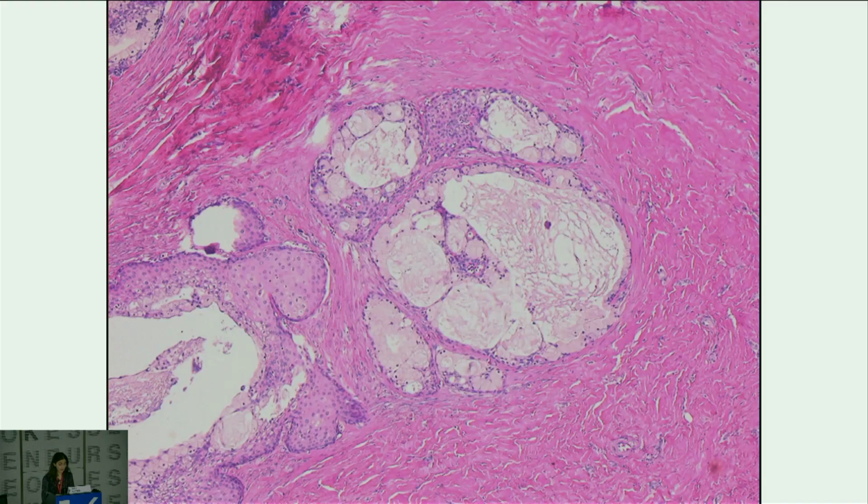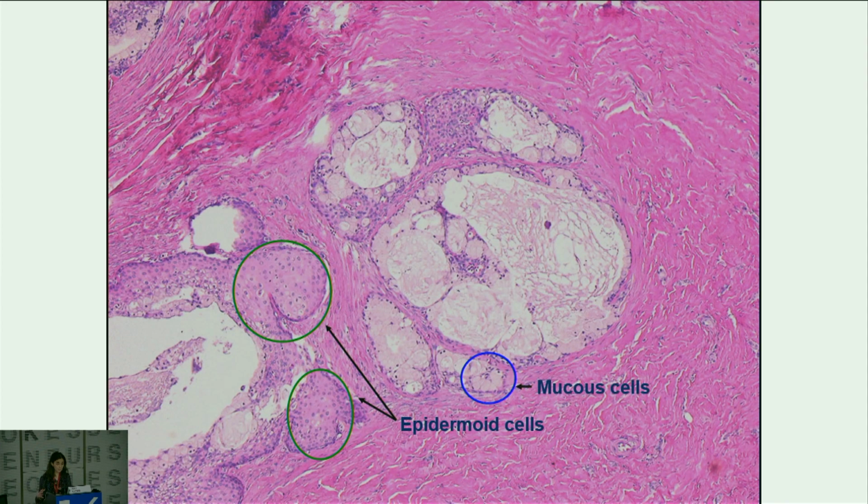Histologically, this tumor is composed of three cell types: the epidermoid cells that have abundant eosinophilic cytoplasm, and they look squamous, similar to the epidermoid or squamous surface; the mucocytes that show abundant intracellular mucin, and they can have signet ring or columnar morphology, often lining the cystic spaces; and the intermediate cells, which are similar to epidermoid cells, but have a more immature appearance with less cytoplasm.